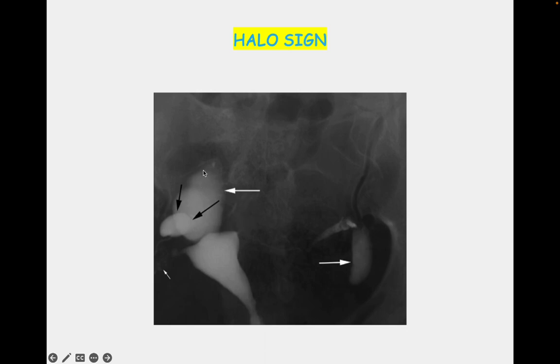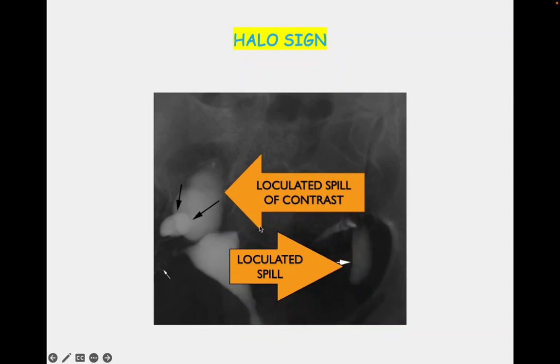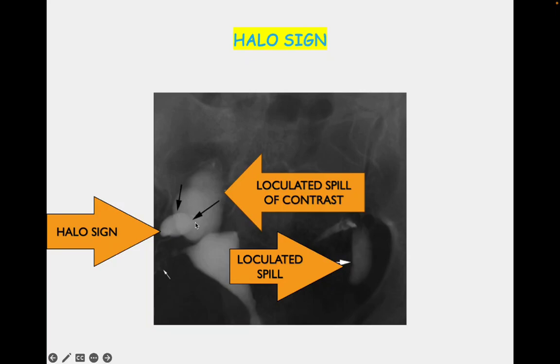Now you can see the halo sign. The loculated collections are visible here, here, and here. This is the ampullary end of the tube. The halo sign appears between the loculated collection and the dilated ampullary end, giving the typical halo sign appearance because of the dilated ampullary end and loculated spill of contrast.